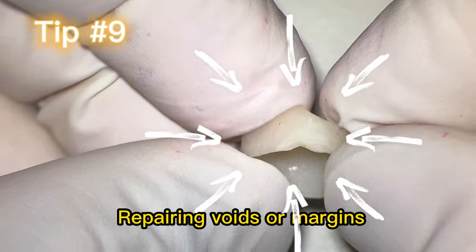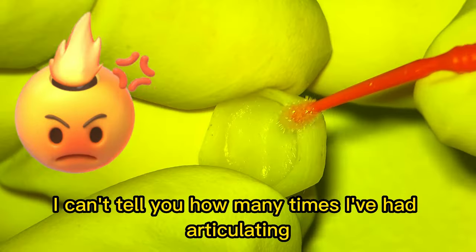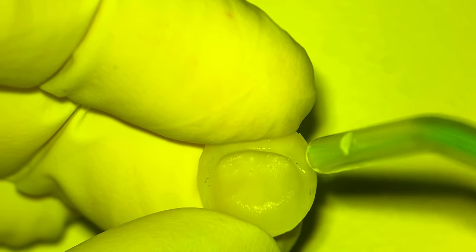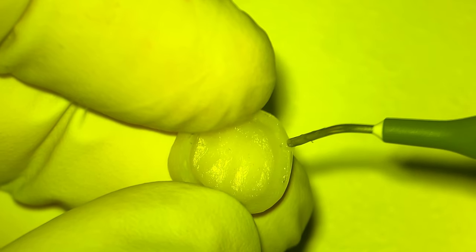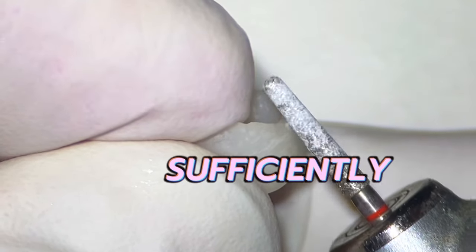Tip number nine: repairing voids or margins — make sure you clean your temp crown before you add to it. I can't tell you how many times I've had articulating paper, blue or red, stained into a void or margin after I repair the crown. Also check the thickness of your temp crown, as it can indicate if you have prepared sufficiently.